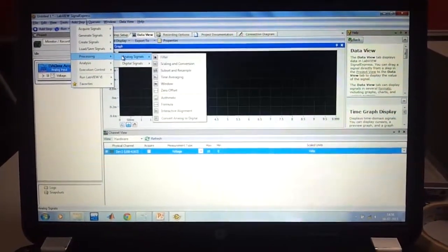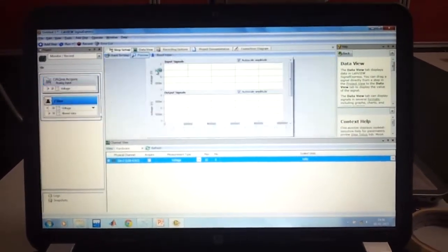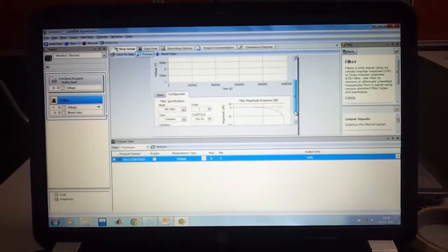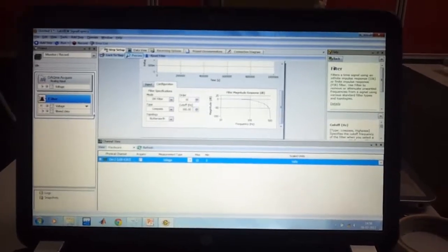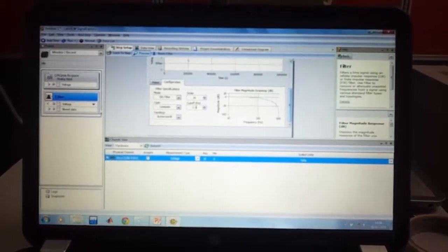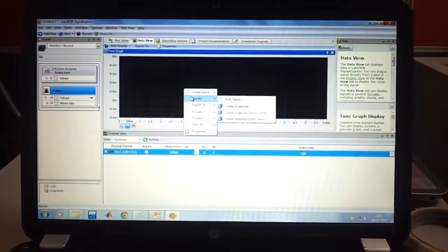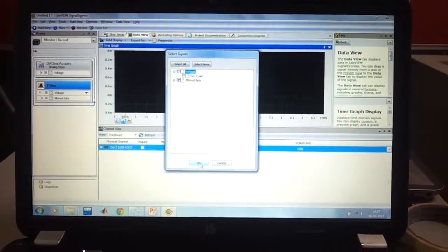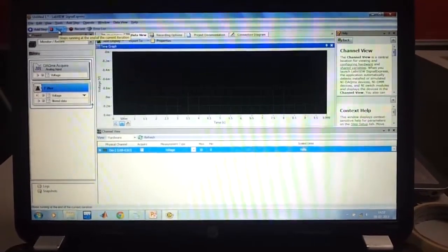The processing of these signals is done using a specific filter. Here I am specifying the cutoff frequency and the order of the filter. Now I add the signals which I am using, that is from the specific channel. And I run the program.